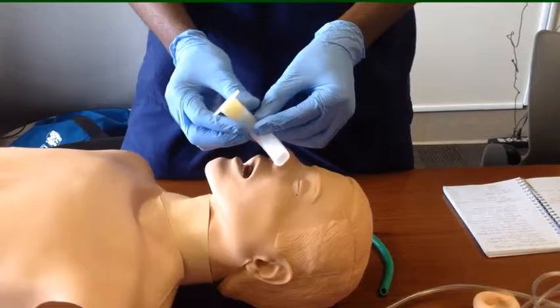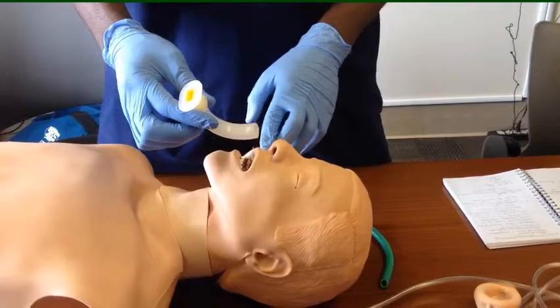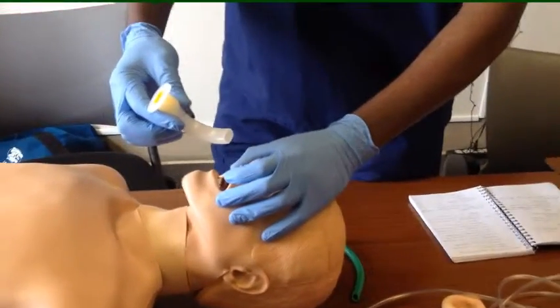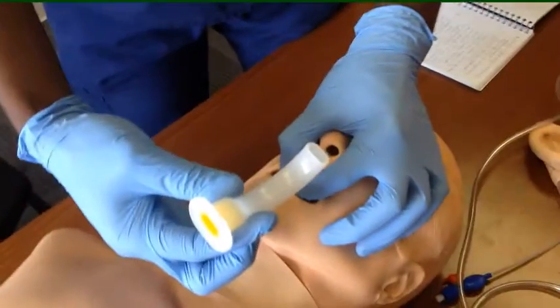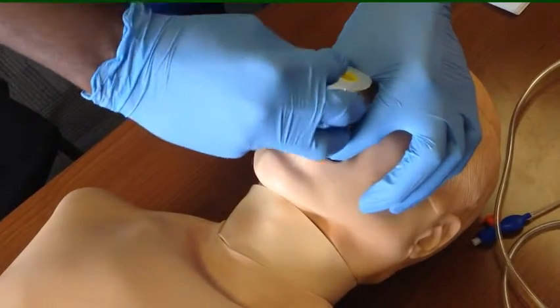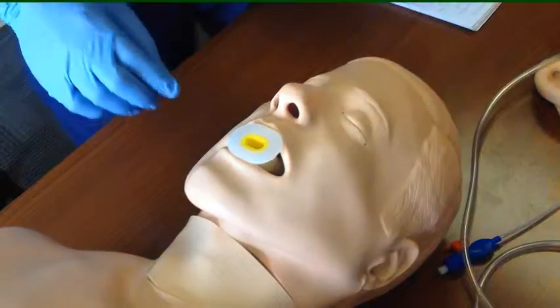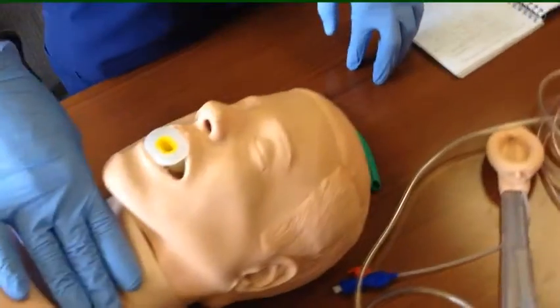When I'm inserting it, you are going to turn it to make it face up, and you use the scissor motion to open the mouth while your oral airway is facing up, and then you put it in, and once it's in, you turn it 180 degrees, and then it's all the way in. So if you had the right size, it should be taking the tongue off the back of the throat.